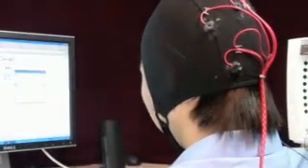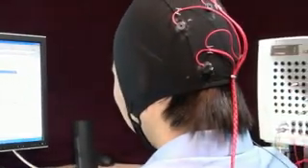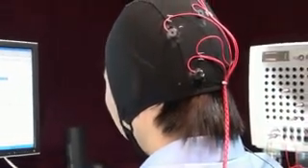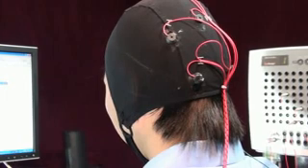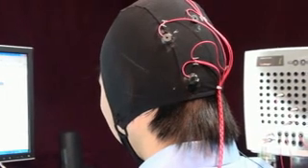The selected letters will be input into the Google search bar. The motion of the vertical bar elicits the visual evoked potentials over the temporo-occipital and parietal cortex, which are responsible for visual motion processing.